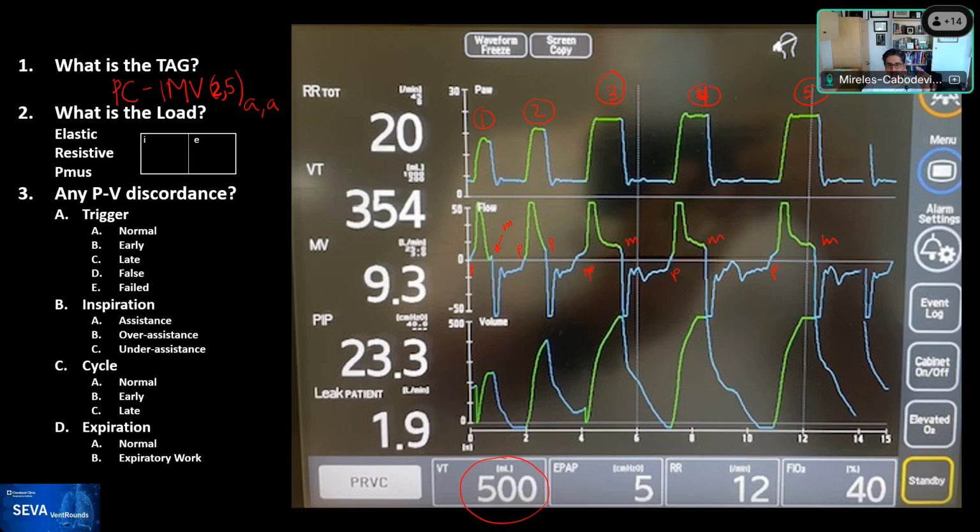Yeah, that's a good question. I think that every mode can be set inappropriately, right? But if a breath is being turned into mandatory, either by the team inappropriately setting inspiratory time minimum or maximum, still it's being converted into a mandatory breath. So by definition, that would be. But I would let Rob comment on that.